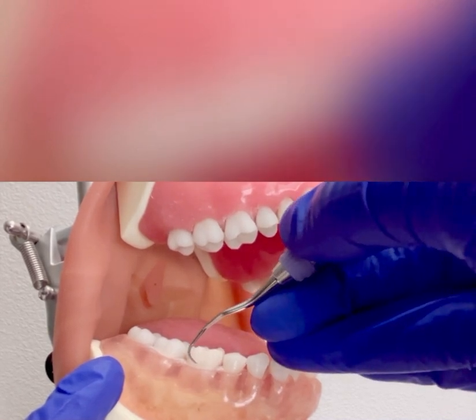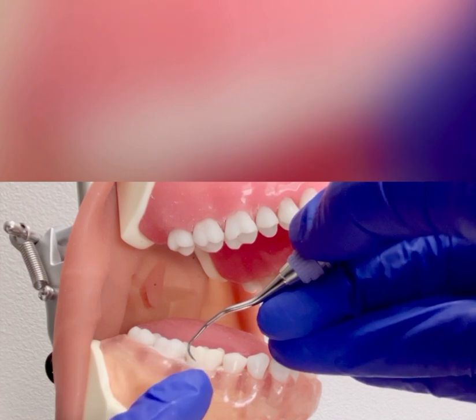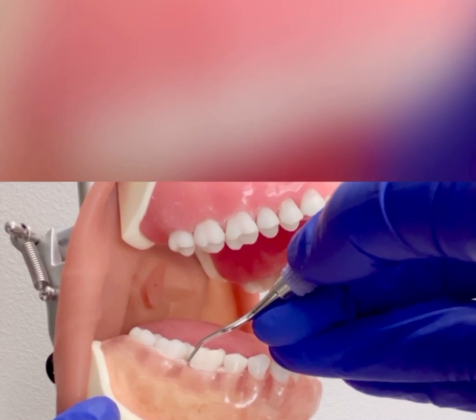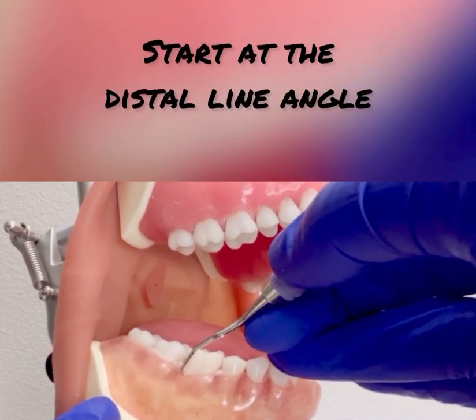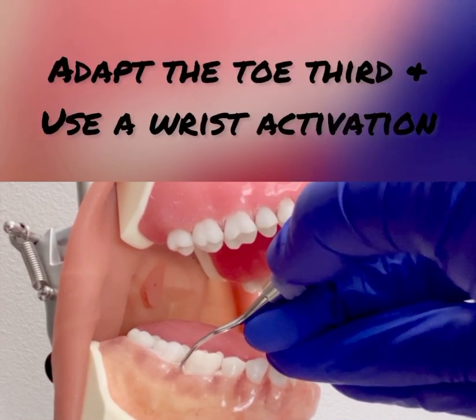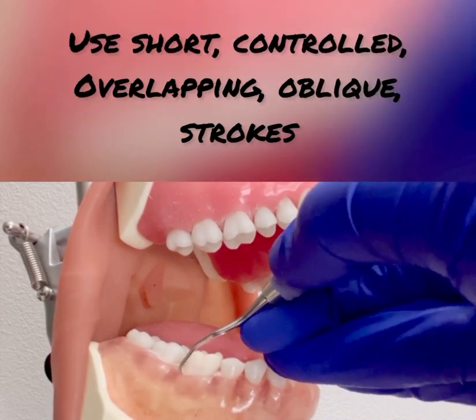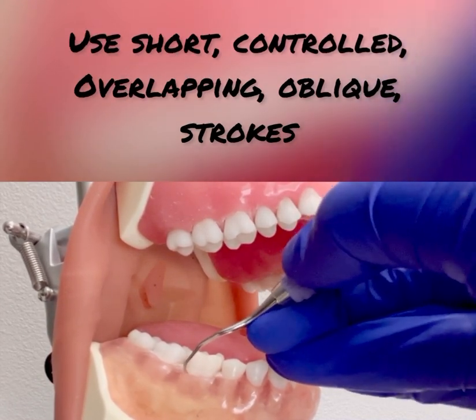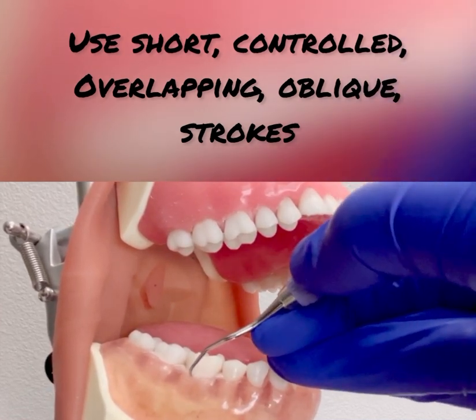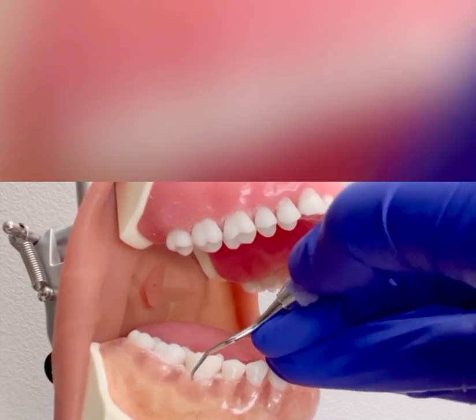Since this instrument can be used on buccal, lingual, and mesial surfaces, start by having the toe pointing towards the mesial. Insert with the back, close the face to the tooth, and insert right at the distal line angle of tooth number 30. Adapt the toe third, which is one and two millimeters, and use wrist activation with short, controlled, overlapping, oblique strokes across the buccal surface.